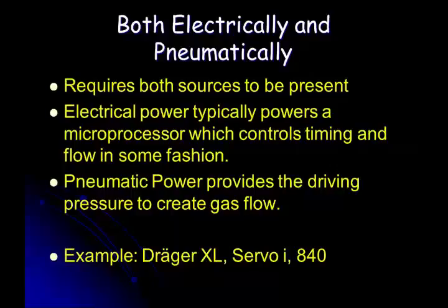All right. Most of the ventilators we're going to deal with, in fact all of them we're going to deal with in the lab, are both electrically and pneumatically powered. You can't run them without having some source gas to power it and electrical power. So electrical power is going to not only control the microprocessor, it's also going to control some internal driving mechanisms, and the pneumatic power has to be there also to create gas flow.